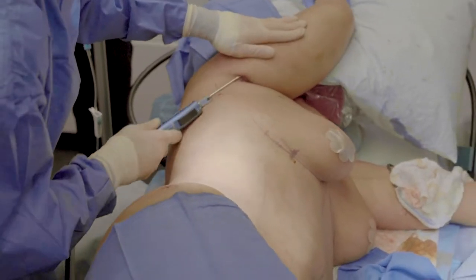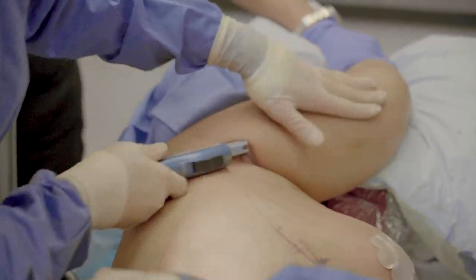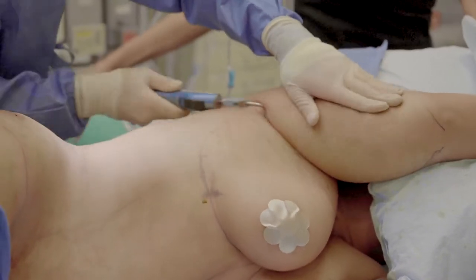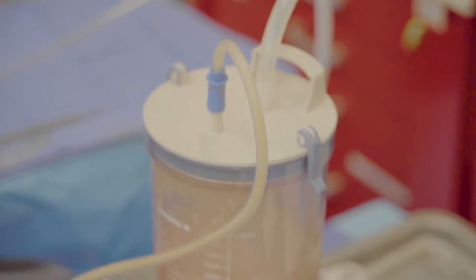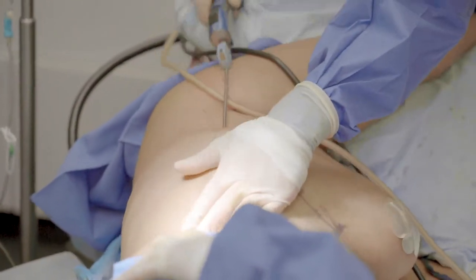A little bit of arm lipo. I don't go 360 degrees — I go underneath the arm, the biceps and triceps area. But on the outside, you don't want to dimple that skin because the fat area is very intricately connected to the skin, so you don't want to lipo that area or you'll get dents. I do about a 280-degree liposuction of the arm, not a 360.